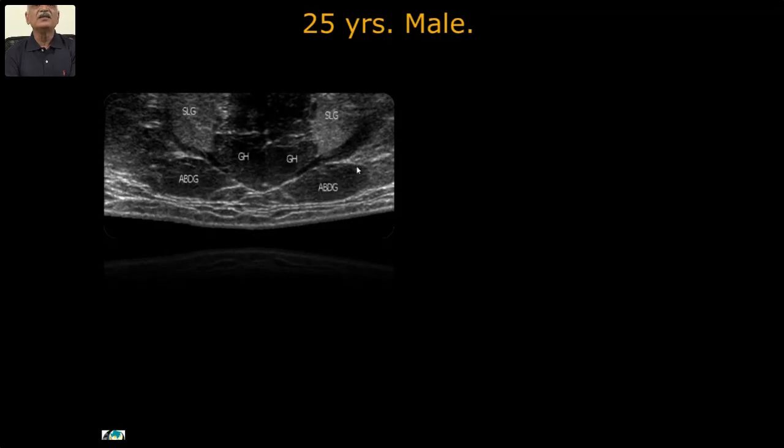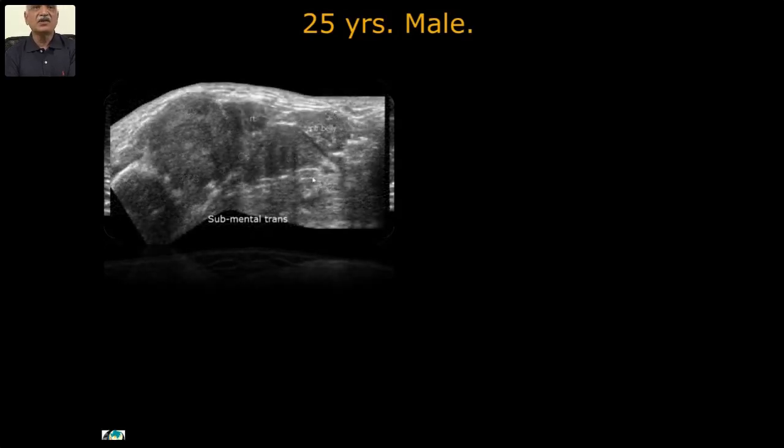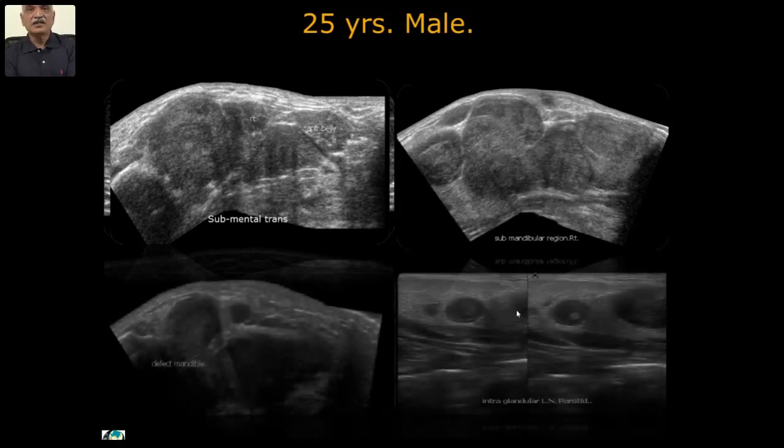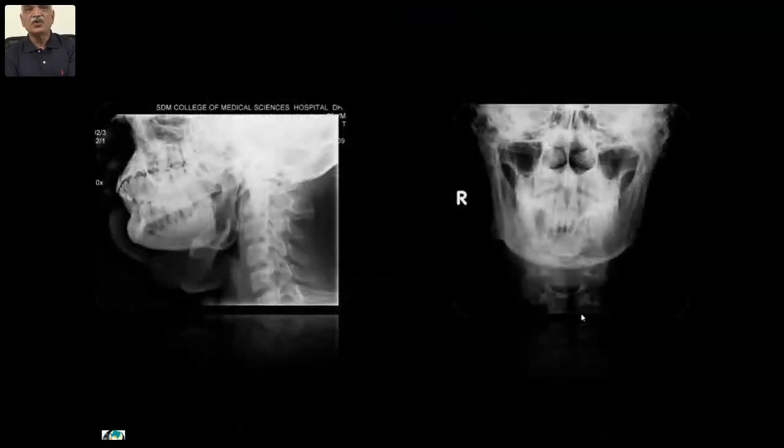I showed you the normal anatomic structures earlier. In this case, you can identify all of these distorted — only the right-left anterior belly of digastric but everything on the right is compressed by nodular big masses destroying the anatomy in the floor of the mouth. There is extensive lymph node involvement, including intra-glandular parotid lymph nodes.